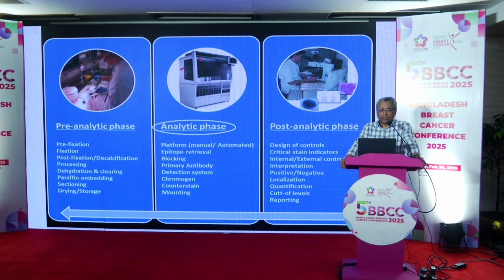And then there's the post-analytic phase, which is how you use your controls, how you interpret the controls, how you interpret your results, and how you report it. So these are all the steps of the post-analytic phase. Of all these 3 phases, the weakest link or the most critical step is the pre-analytic phase. That's where most of the problems happen.